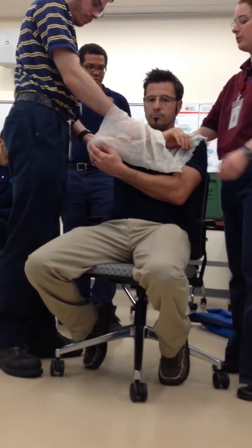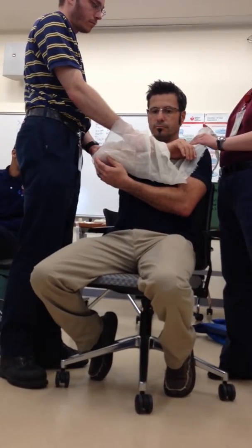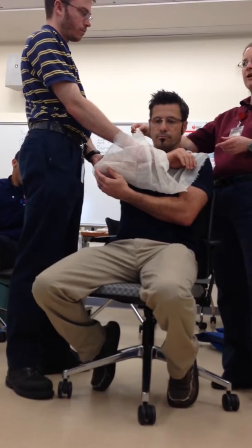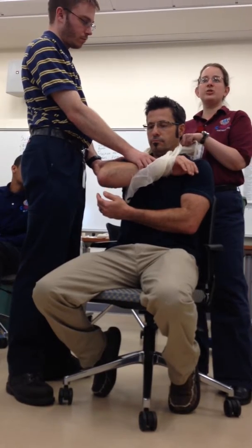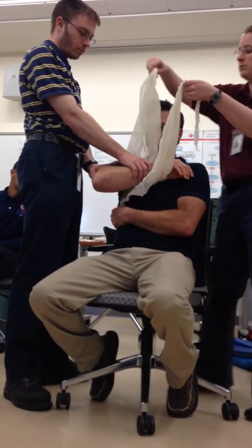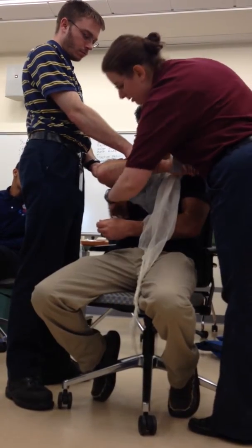And this is kind of critical. If you do this backwards, meaning you see how there's a part that's underneath the arm and there's a part that's over the arm? If you switch them, meaning it looks like this, you're going to pinch the person's neck. It looks very similar, right? But it's backwards. Lay this nice and pretty again.